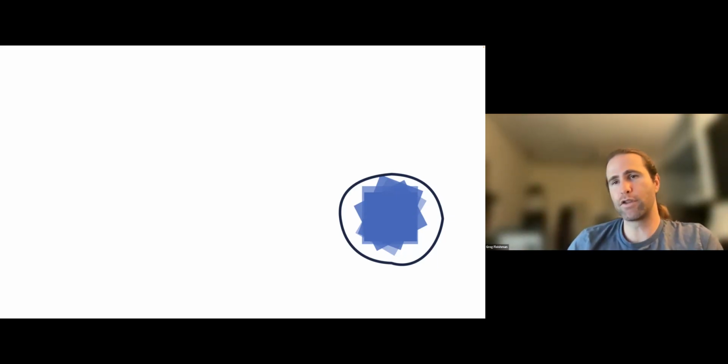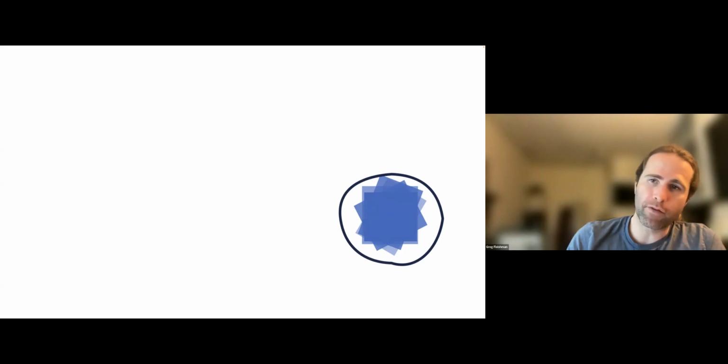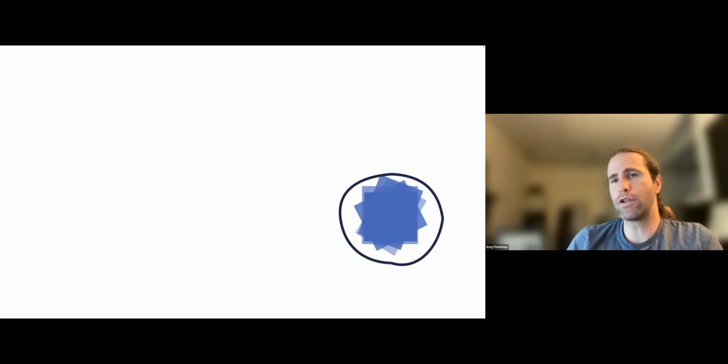For that subject, some small part of the brain might be incorrectly aligned. For a different subject, a different part of the brain might be incorrectly aligned. And just using this first round of registrations to the one single target accumulates all of those errors.